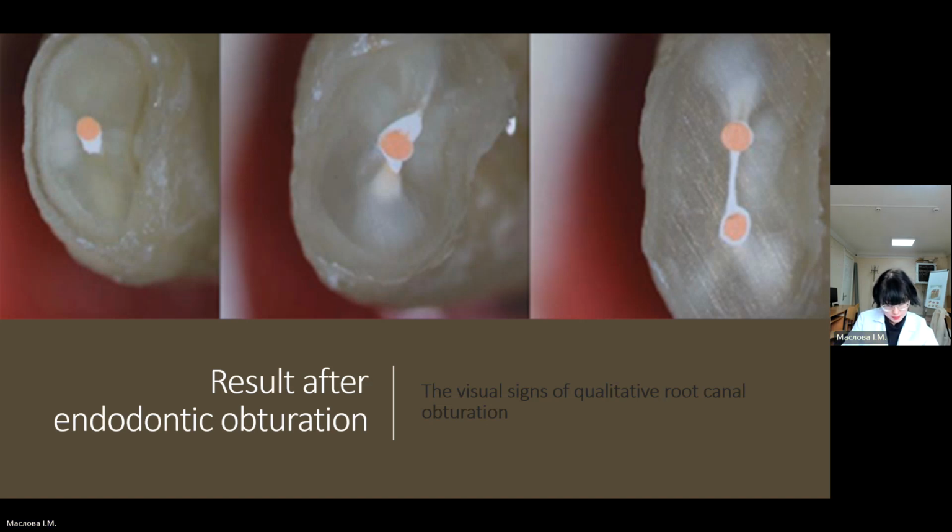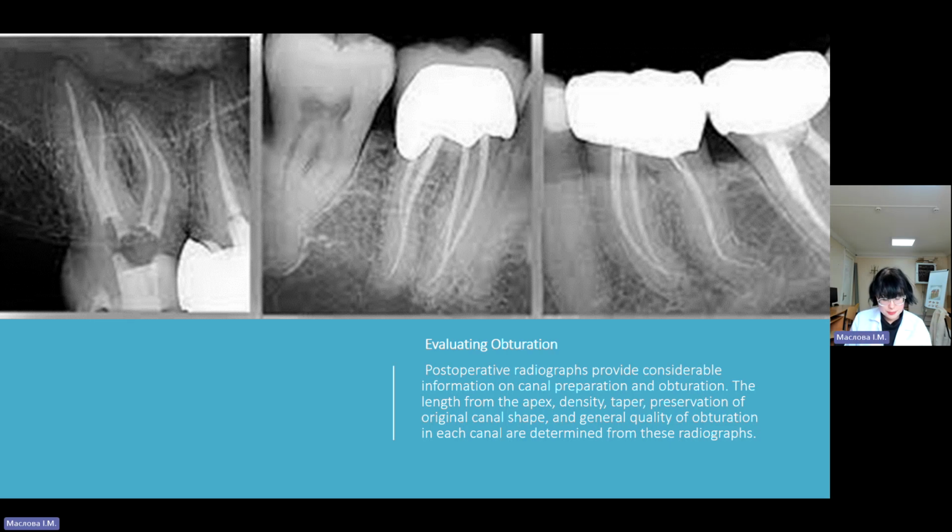Radiographs perform essential functions in 3 areas: diagnosis, treatment, and postoperative evaluation or follow-up. Each of these has limitations that require its own special approach.